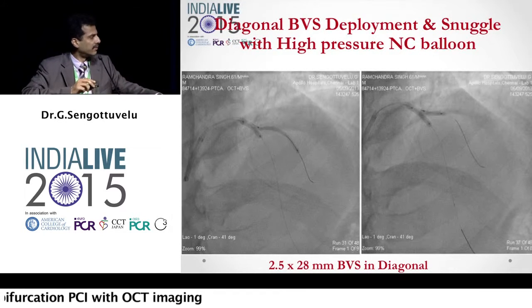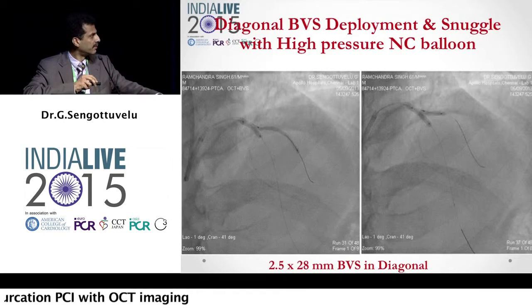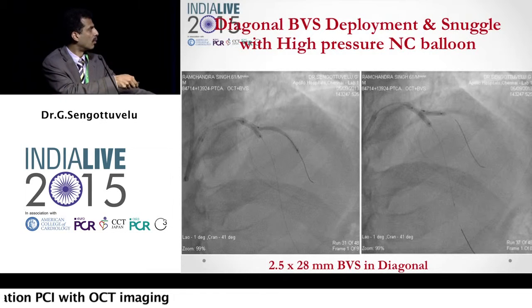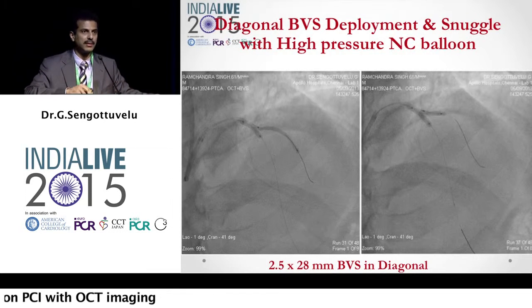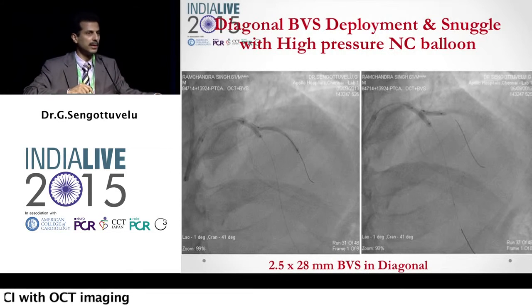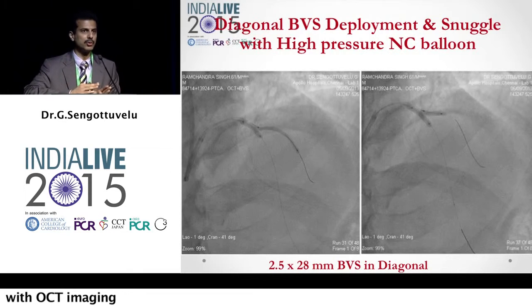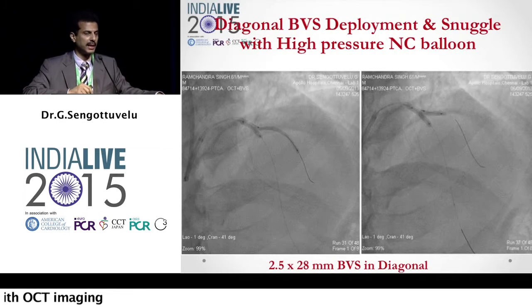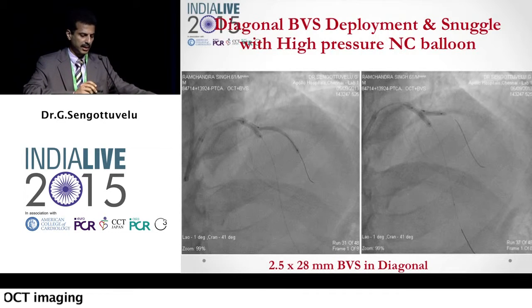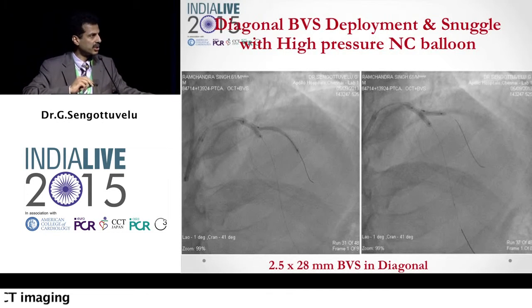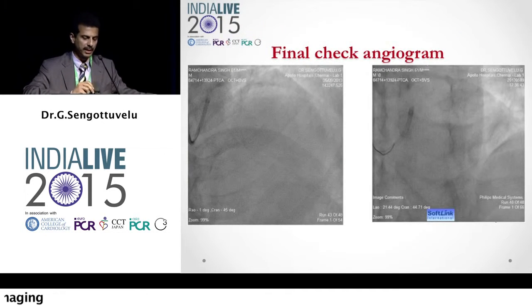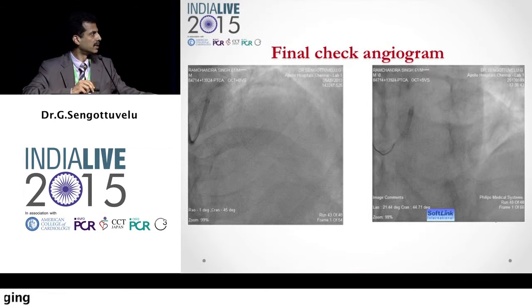The point here is that we used a snuggle balloon dilatation, wherein we have not overlapped the balloons, so that the traditional kissing balloon is avoided when using an absorb scaffold — respecting the rules of not over-expanding beyond the recommended limits. Once we deployed the absorb in the diagonal, we did a high-pressure snuggle using two short non-compliant balloons, going up to 20 to 24 atmospheres.